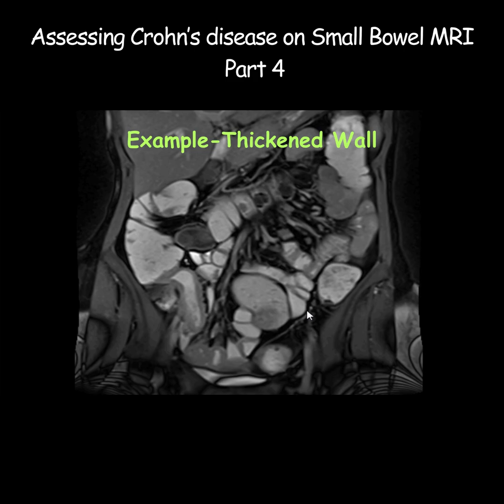Compare it with the wall of an adjacent small bowel loop. You can compare with the walls of these small bowel loops — do you see a difference? When you spot an abnormality like this, consider the possibility of abnormal small bowel wall thickening, and the next step is to measure it. This measures about 0.8 centimeters, definitely above 3 mm.